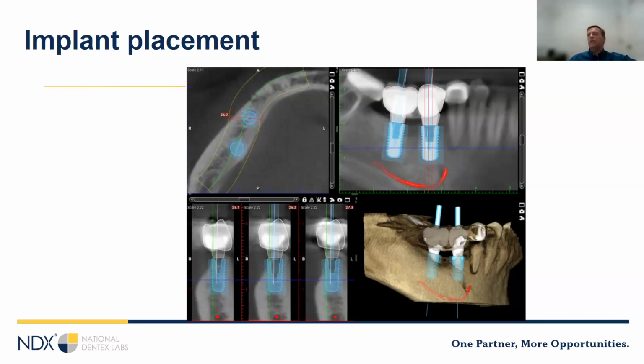With most of these cases, we're going to be moving the tooth position a little bit. So one of the challenges with placing implants is that we tend to place them based on the surrounding teeth. But if our goal is to get the teeth to a new position and have them in the right position, you're really going to have a better result with a guided case, I think, in these situations.